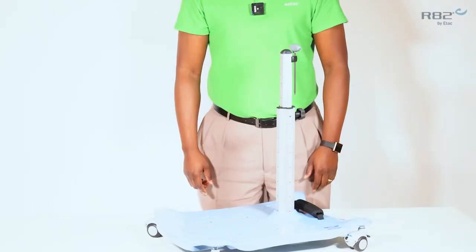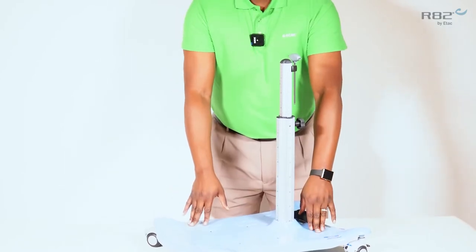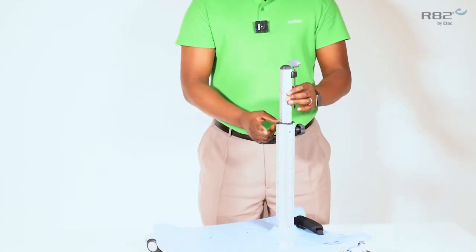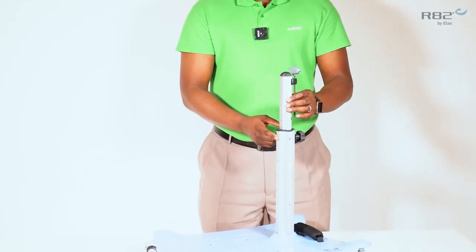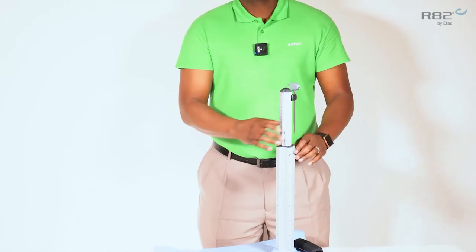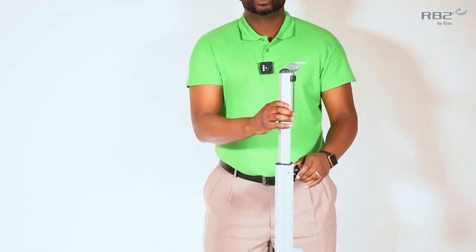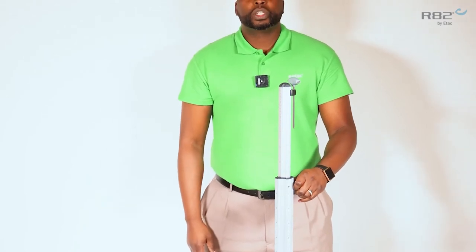The size 2 and the size 3 Meerkat share the same base. The difference is the height of the adjustable column. On a size 2, the column will adjust to 39 inches. On a size 3, the column will adjust up to 50 inches.